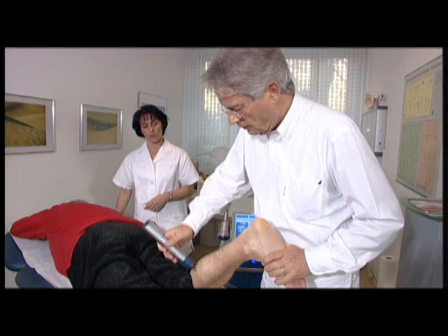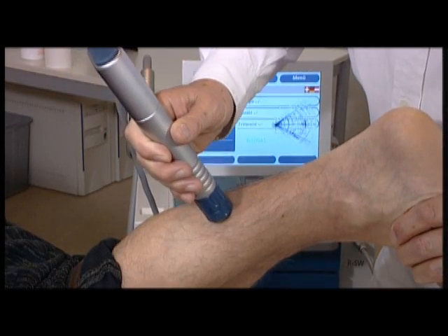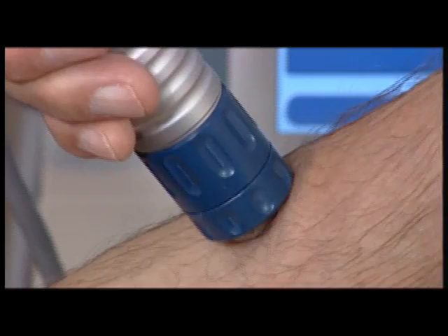The shortening of adjacent muscles caused by the referred pain and the trigger points thus provoked can be effectively treated with pressure waves by using the Duolith D-actor.